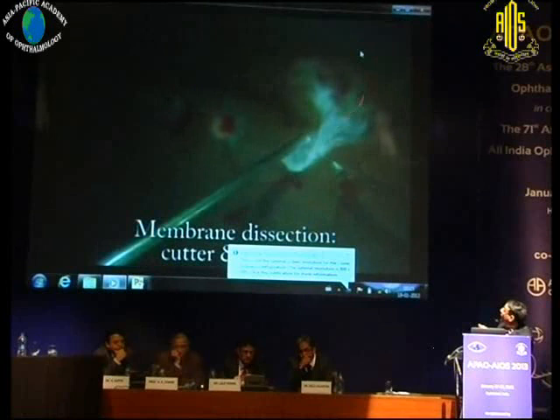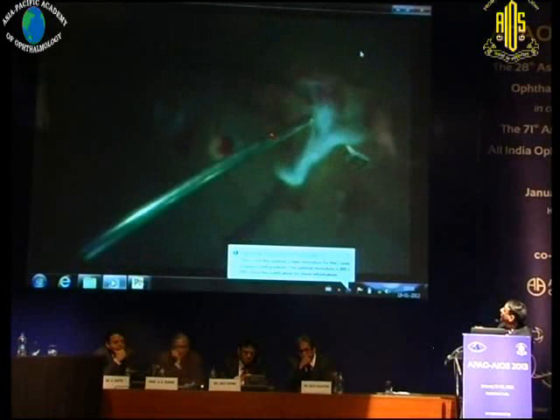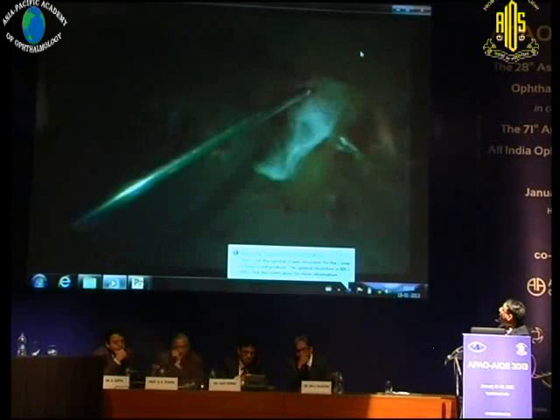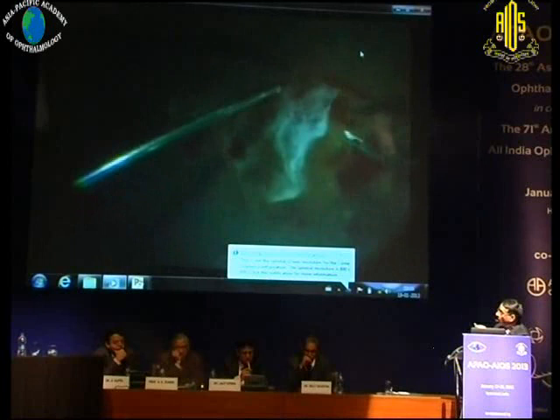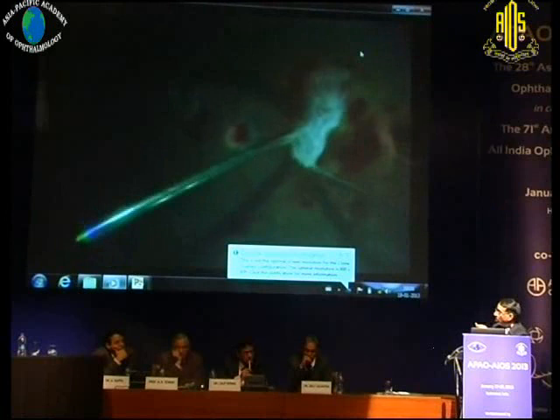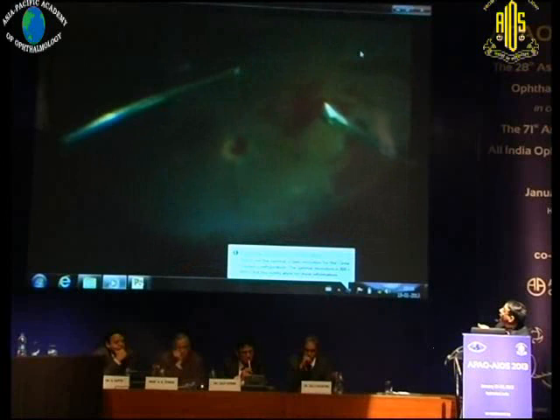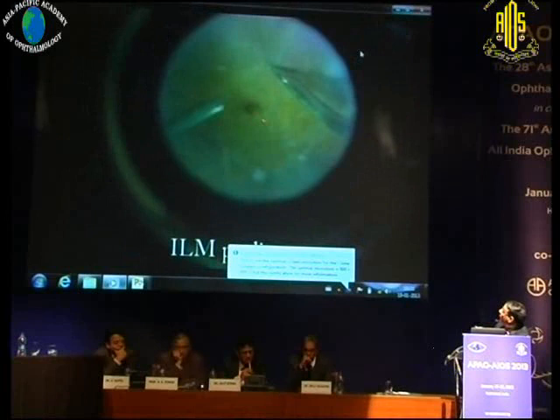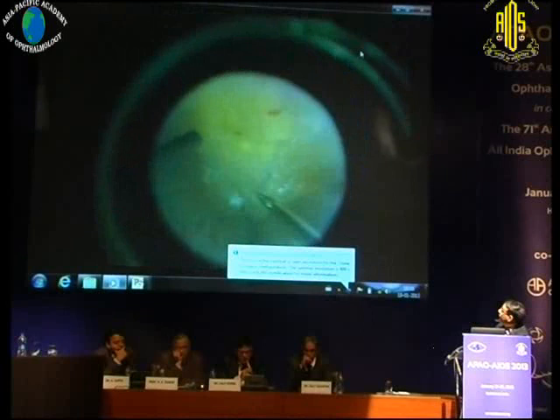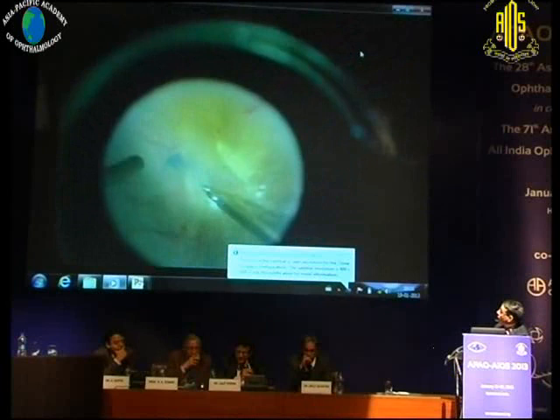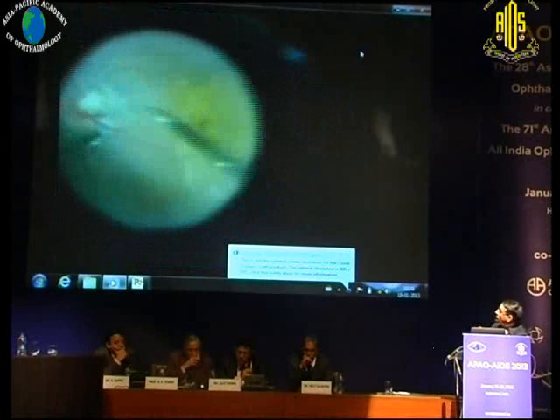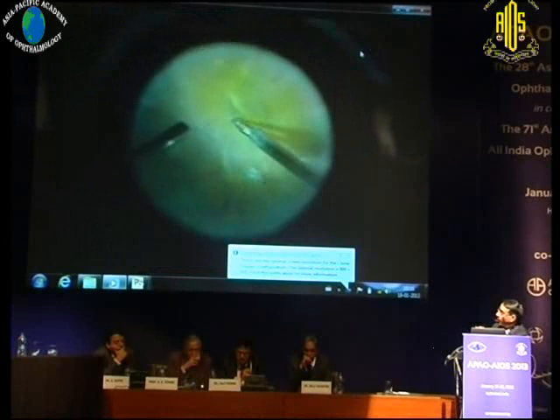This was an interesting case — a PDR with a large membrane over the posterior pole, but alongside this there was also a macular hole. Sometimes you can iatrogenically create a hole when removing the membrane if there's an attachment at the fovea; in those cases you proceed with ILM peel and gas and treat it as a macular hole. Here there was a pre-existing hole — you can see us using a cutter and scissor bimanual combination, then applying brilliant blue to confirm the macular hole, and then performing the ILM peel. ILM peeling in these cases is more difficult than in typical macular hole situations because the retina is not healthy — it's boggy. You cannot use a Tano scraper; it's almost mandatory to use forceps with the pinch-and-peel technique.